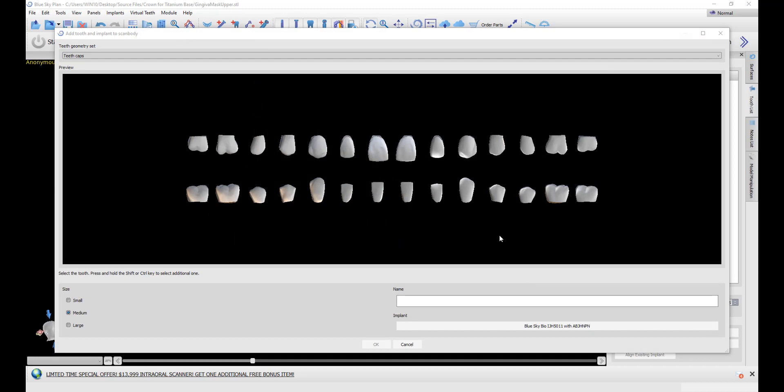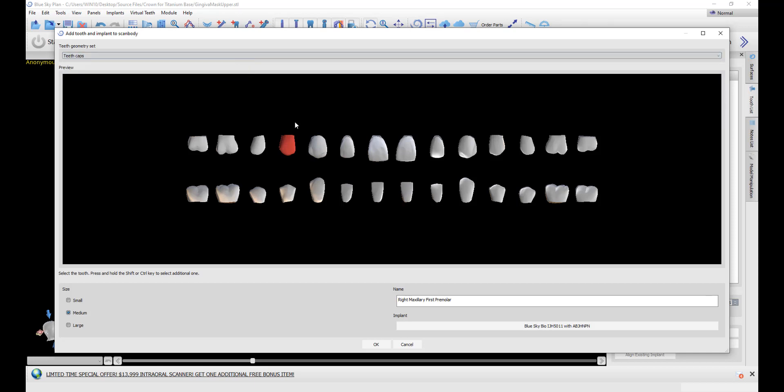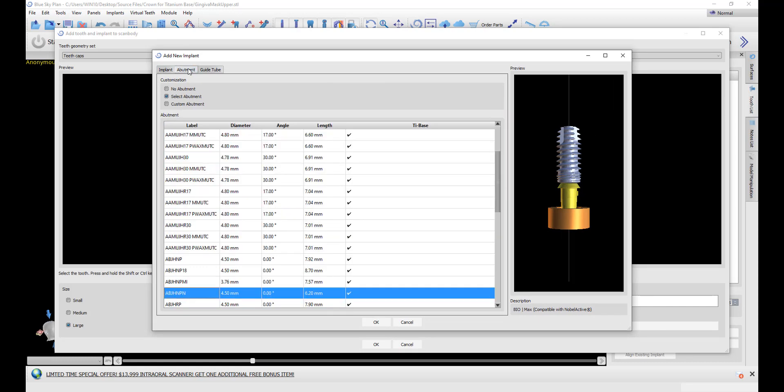The software automatically prompts us to select the relevant tooth. We have several different tooth libraries. Click once to select the relevant tooth. Select small, medium, or large. At this point you also want to select the relevant implant and the relevant titanium based digital abutment. Select the relevant implant, select the relevant abutment, and then click OK.